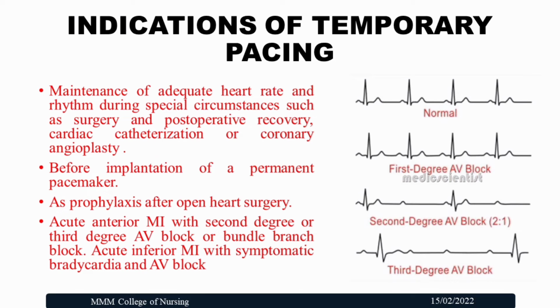Let's see the indications of the temporary pacing method. One is maintenance of adequate heart rate and rhythm during special circumstances such as surgery and post-operative recovery, cardiac catheterization or coronary angioplasty, before implantation of the permanent pacemaker, and as prophylaxis after open heart surgery. Others are acute anterior myocardial infarction with second degree or third degree atrioventricular block or bundle branch block, and acute inferior myocardial infarction with symptomatic bradycardia and atrioventricular block.